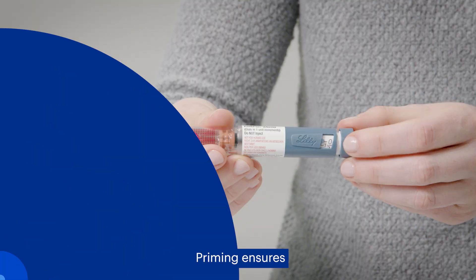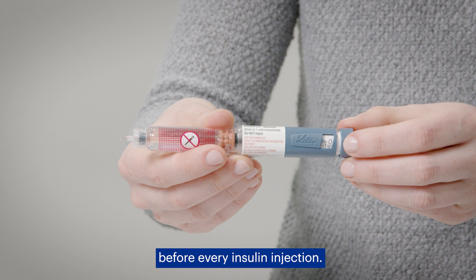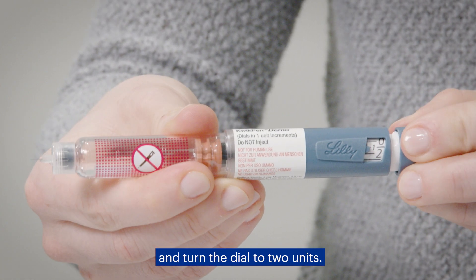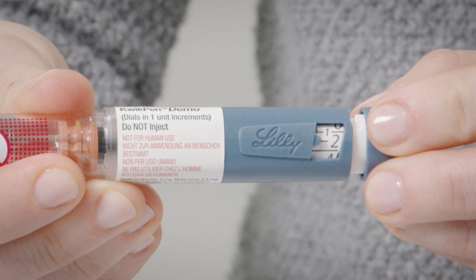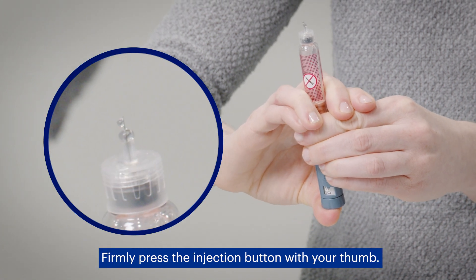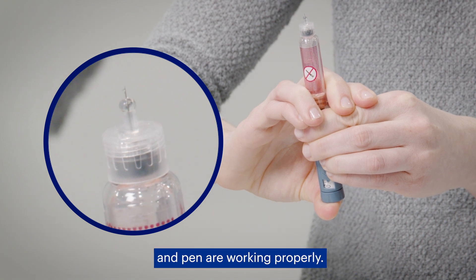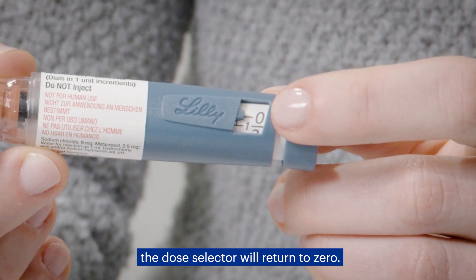Prime your pen. Priming ensures the pen and needle are working properly, and it's important to do this before every insulin injection. Look at the dose window and turn the dial to two units. The arrow in the dose window should line up exactly with the number you need — you can dial the arrow back if you go too far. Hold your insulin pen so the needle is pointing up, then firmly press the injection button with your thumb. Drops of insulin will come out of the tip of the needle, which means the needle and pen are working properly. After you prime the pen, the dose selector will return to zero.